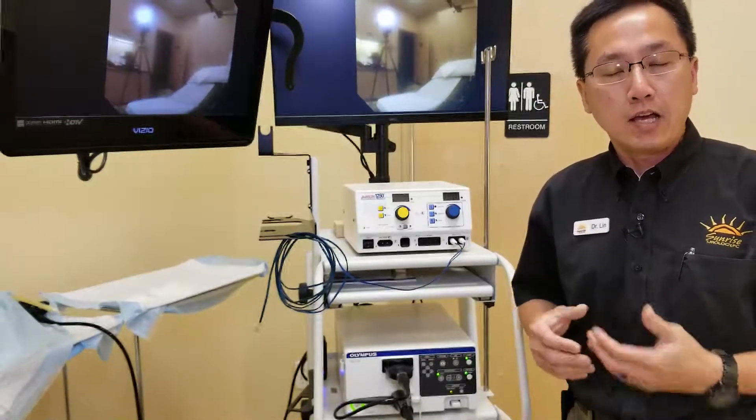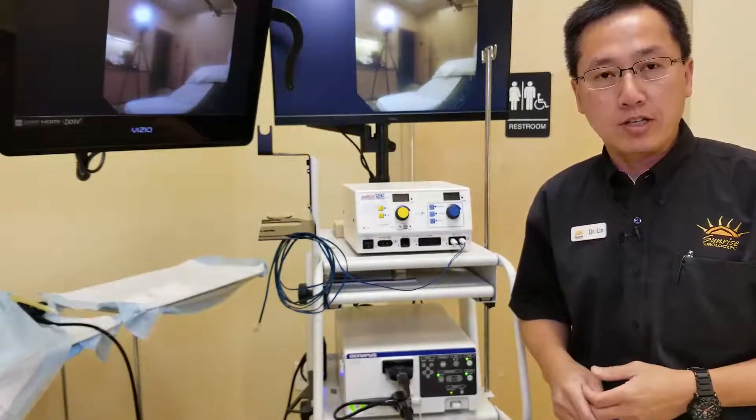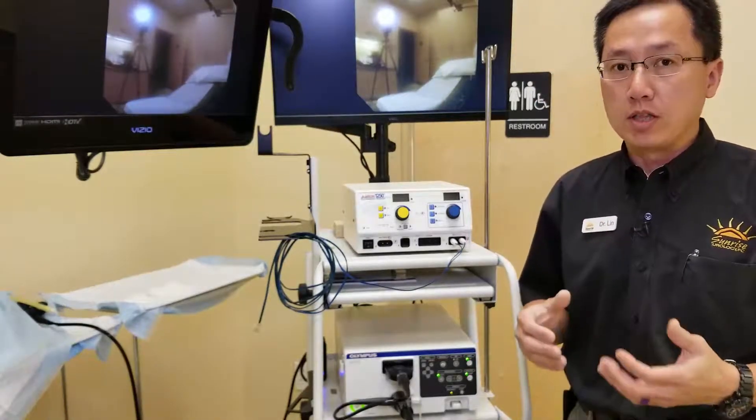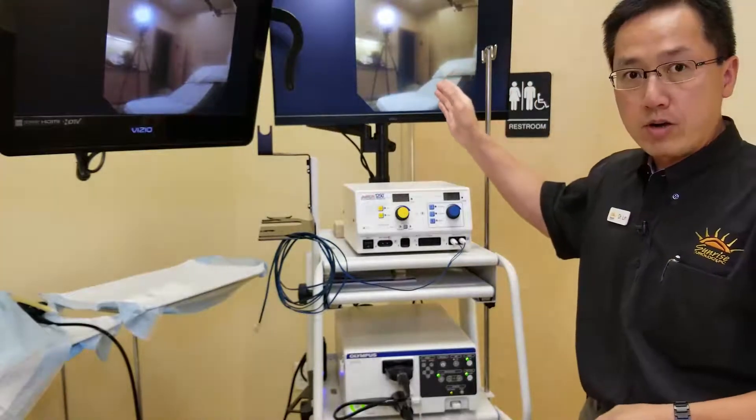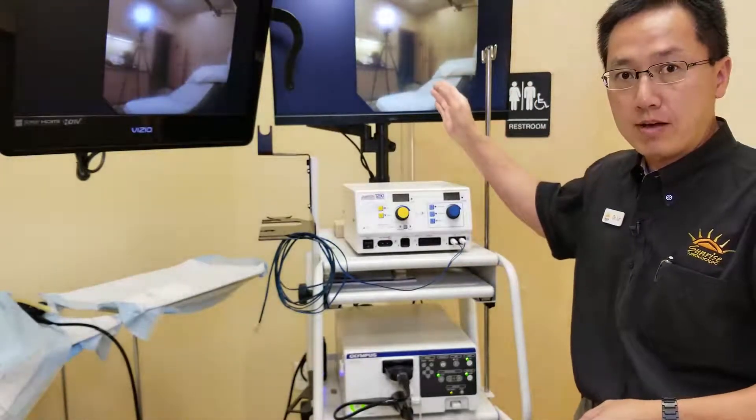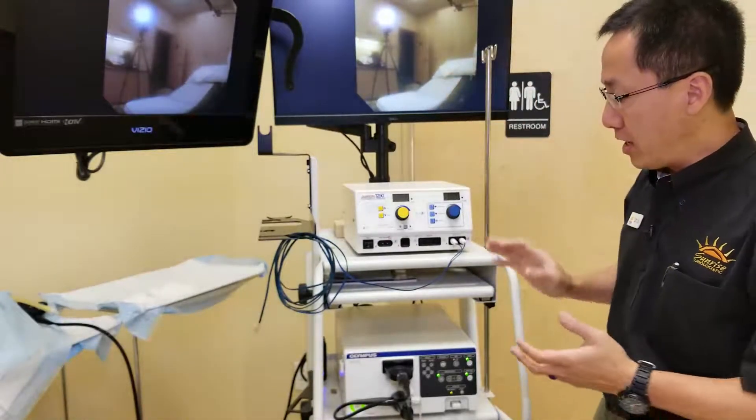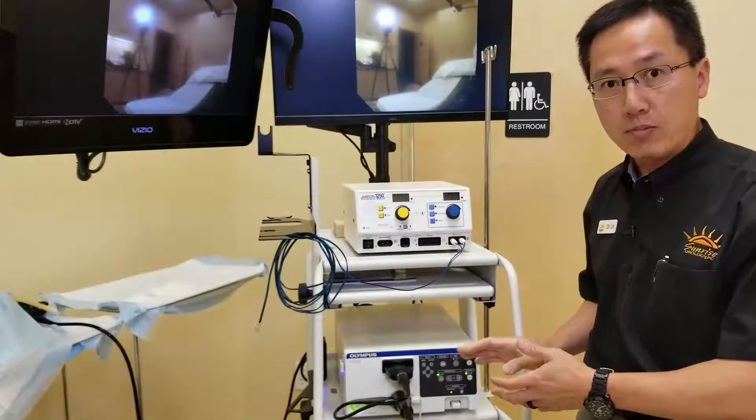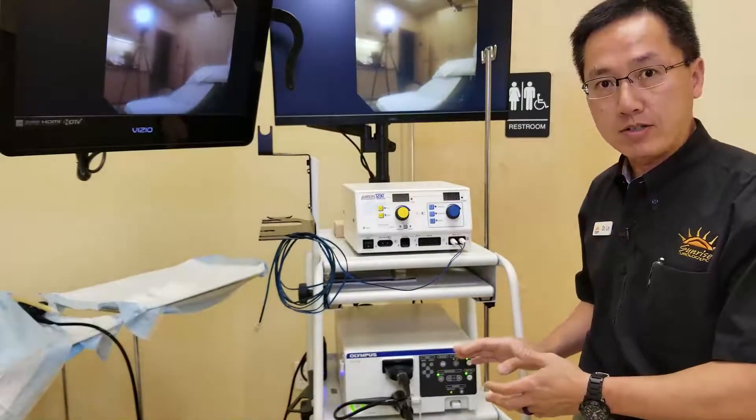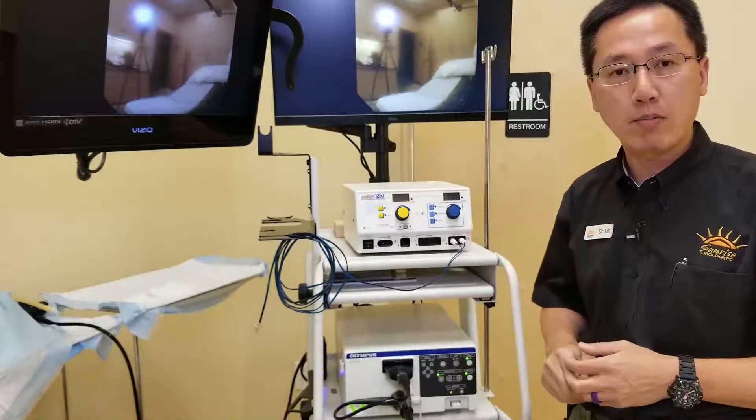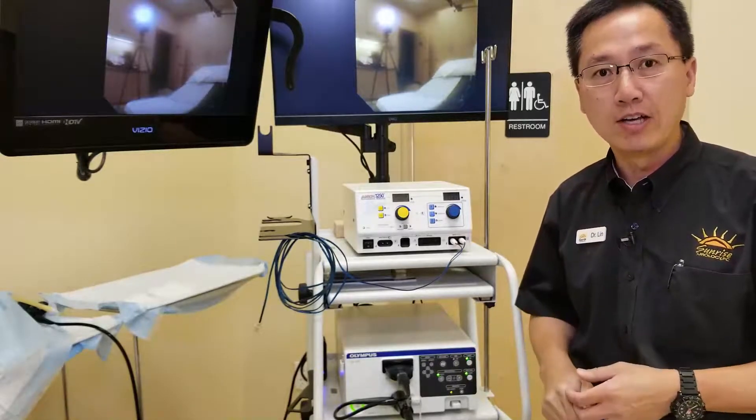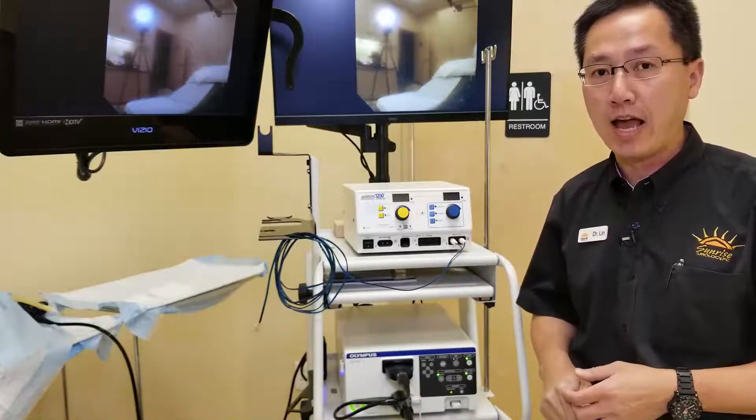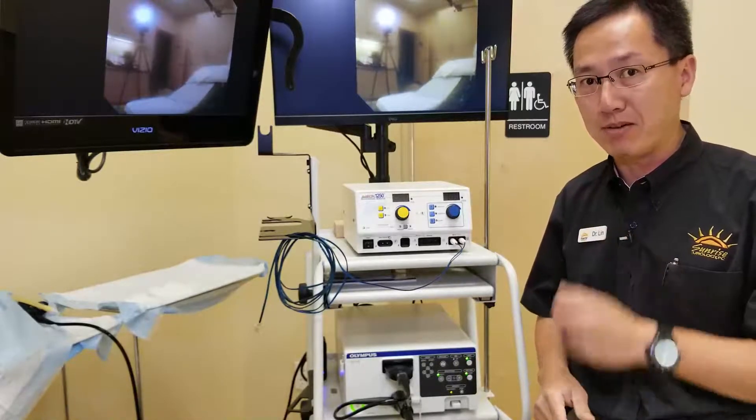You do not need an unlimited budget to deliver remote video imaging setup on your Olympus video towers. In this video, I'm going to show you an inexpensive way to get this to happen.